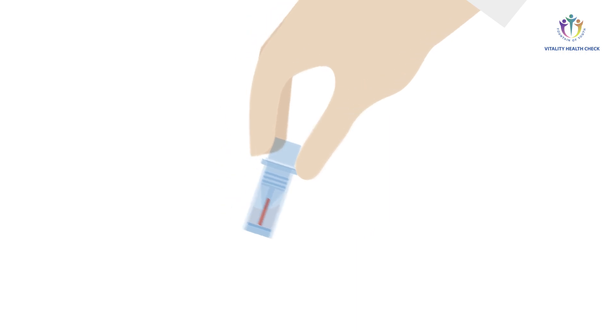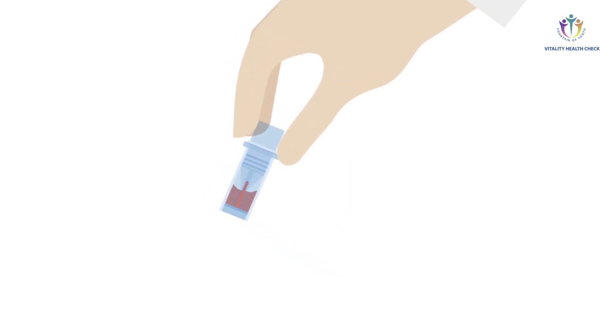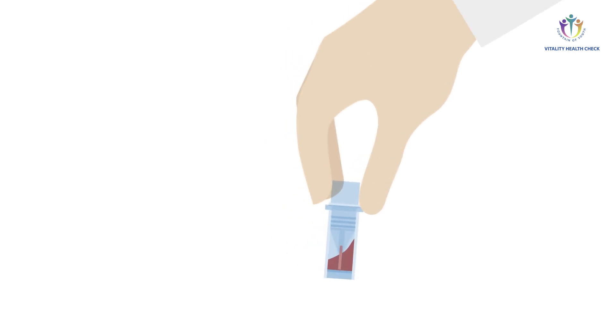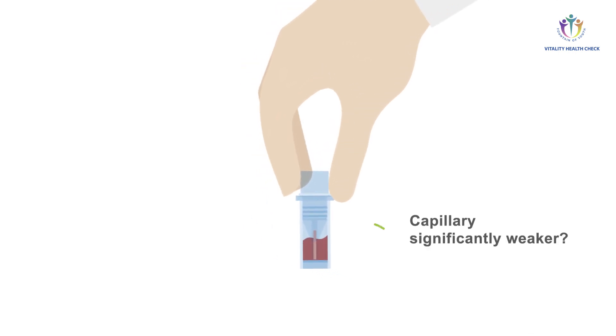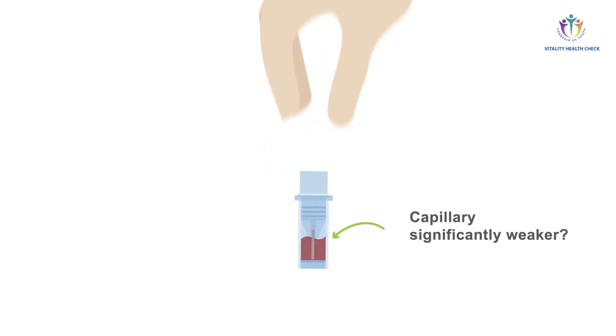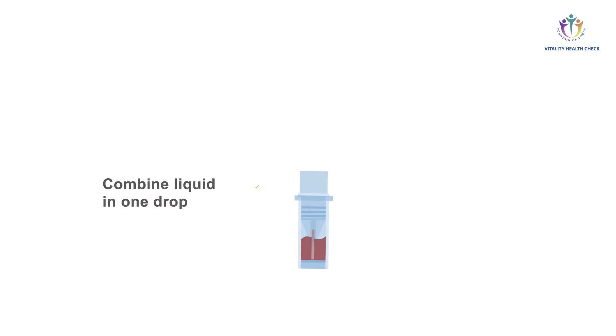Always check your result in transmitted light. The centrifugal force must pull the sample out of the capillary and into the sample buffer before it absorbs liquid again. Complete mixing is achieved once the liquid in the capillary appears to be stained weaker than the pre-mix at the bottom of the collection tube in translucent light. Once the pre-mix is completed, make sure that all liquid is combined in one drop at the bottom of the collection tube.